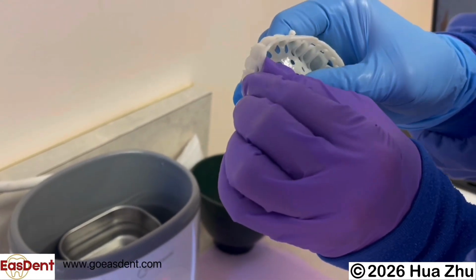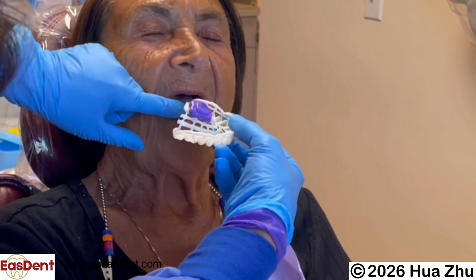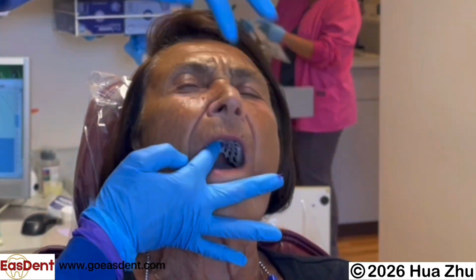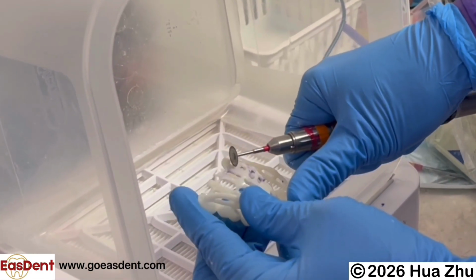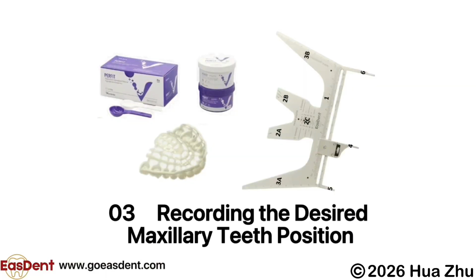You can also load fast-set bite registration material at the area and put the tray in the mouth. You can quickly identify the exact location that prevents seating. You can use the same method to identify the area for the tuberosity. Use the acrylic burr or disc to cut away the areas that show through.